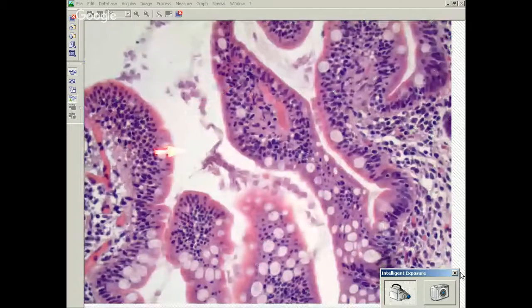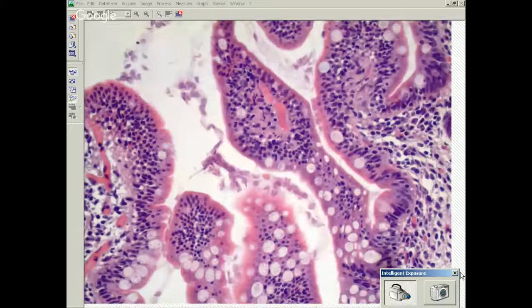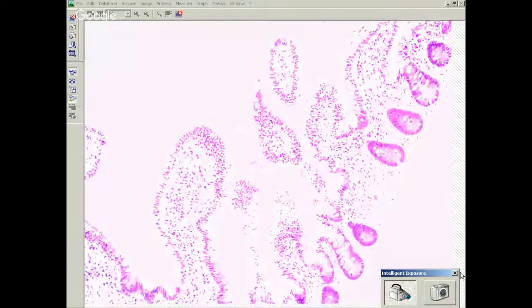So Giardia, these are trophozoites. When they are infective, they'll be cysts. So people swallow the cysts, and then they excyst and become trophozoites. And they actually like to be in the duodenum, which is why this location is kind of strange for Giardia. And I actually had Rifat double check to make sure that this wasn't duodenum.